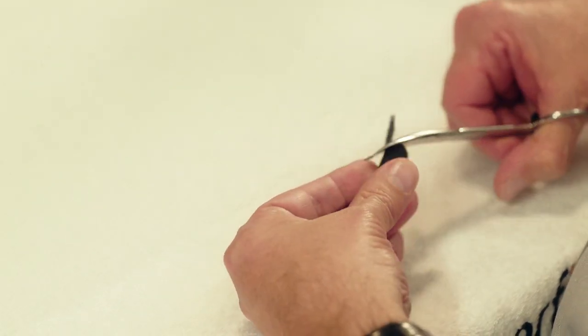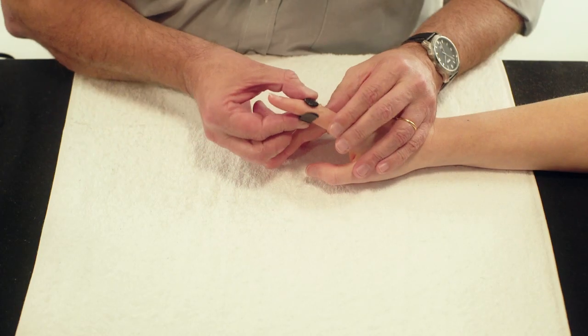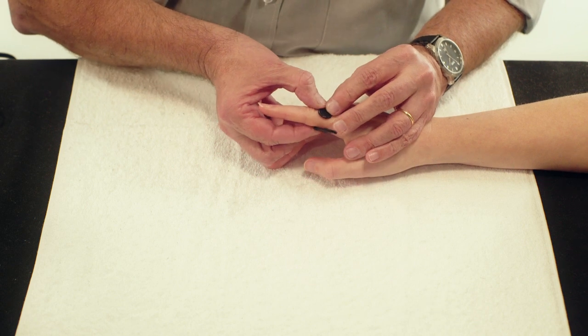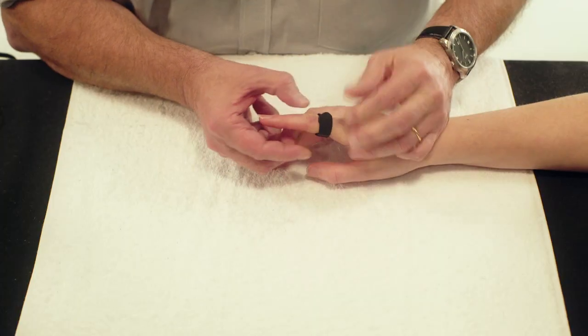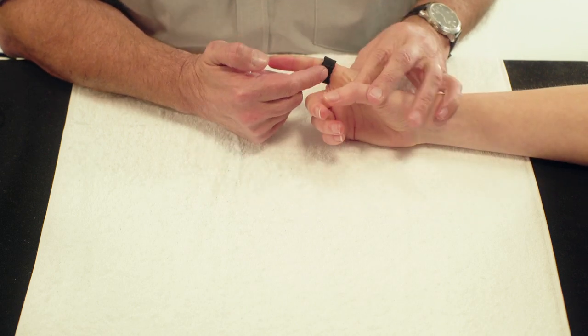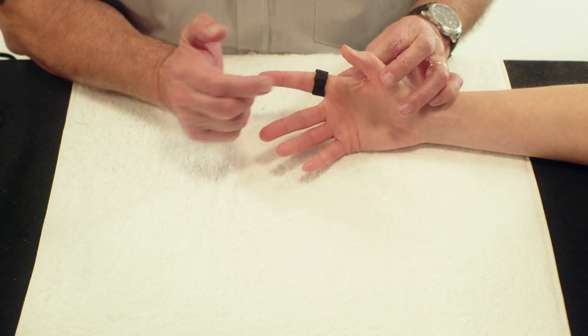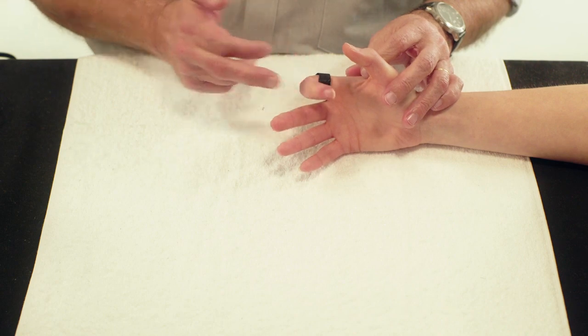Round the corners of the velcro loop. Try the orthosis on the patient's finger. The orthosis will exert a pressure on the sheath of the flexor tendon, enabling the flexion of the injured finger again.